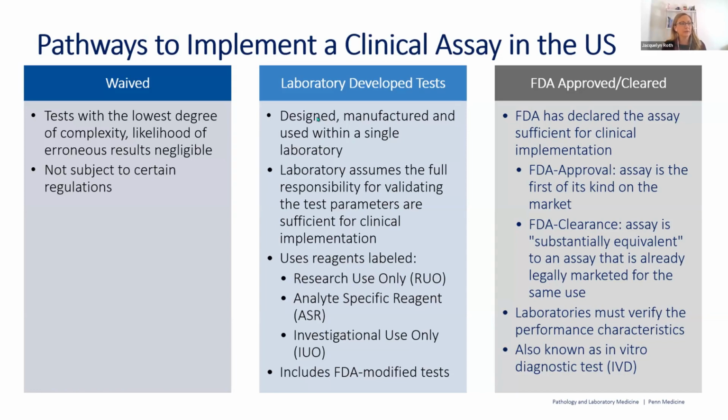In the middle here are the laboratory developed tests, and these are the bulk of tests, at least that you are going to see in clinical labs in the United States. These are designed and manufactured and used within a single laboratory, meaning we can't become a manufacturer or company and sell our tests. That's not allowed. We assume the full responsibility for validating these tests.